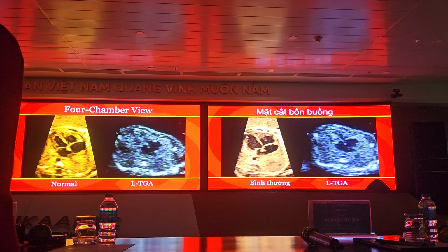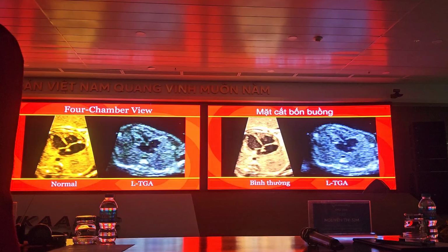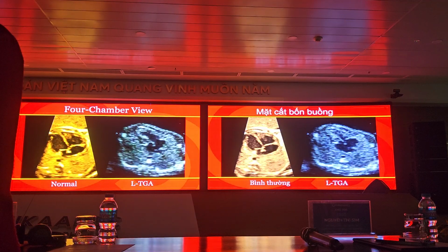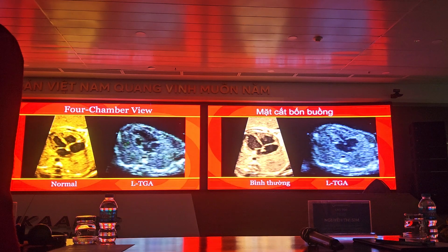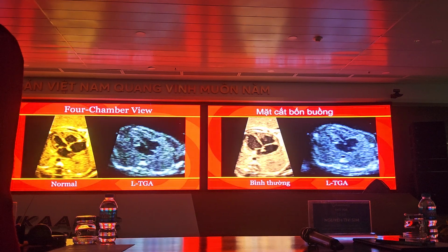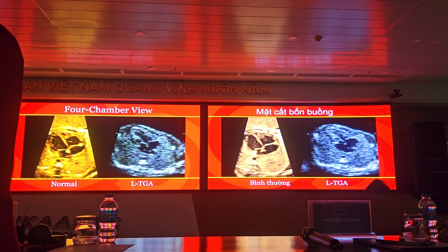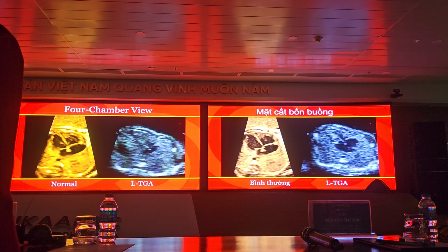We know it's a left ventricle because it's smooth walled and it has a mitral valve. And we know it's a mitral valve because it's more towards the base. The tricuspid valve is more apical. And you can see the right side of the heart, which is the right ventricle, is hypoplastic. So these are abnormalities that we commonly see with LTGA, but it's related to the ventricular inversion.